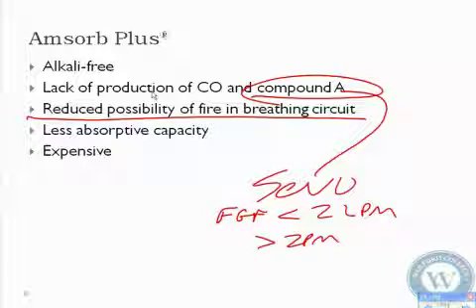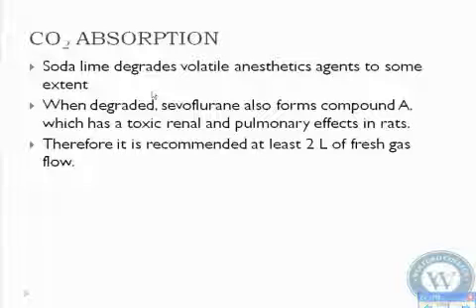But you saw earlier that it's not very absorbable. I mean, you're only going to get, what, 10.6 or something compared to 26 of soda lime, and it's much more expensive. I think it's like 3 times the cost. So I've never seen it. I don't know anybody that uses it, but I would expect anytime you see people that use products like that, it's because they had a bad outcome on a patient related to something. I mean, that's when they switch over. Okay. Oh, well, I just talked about this, so we can keep moving on.